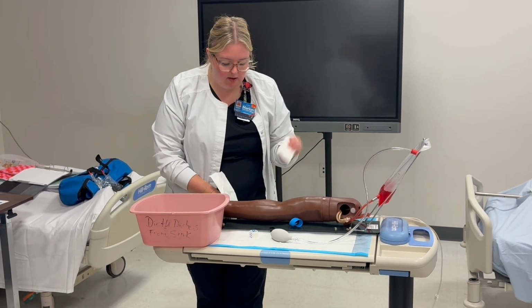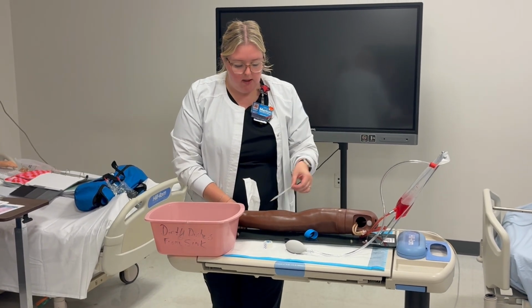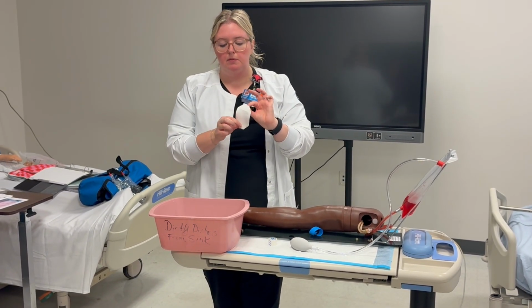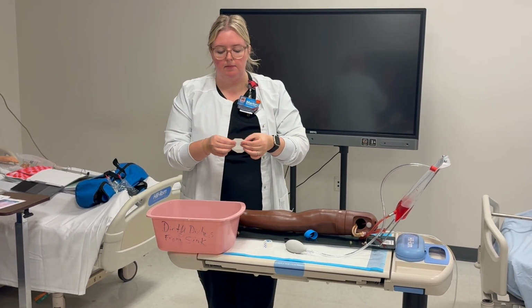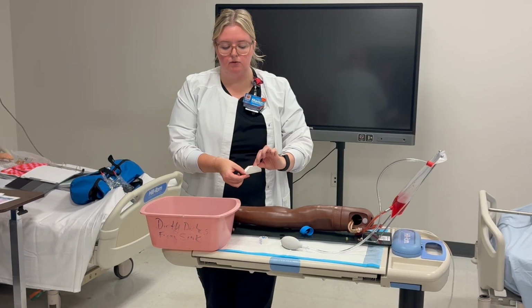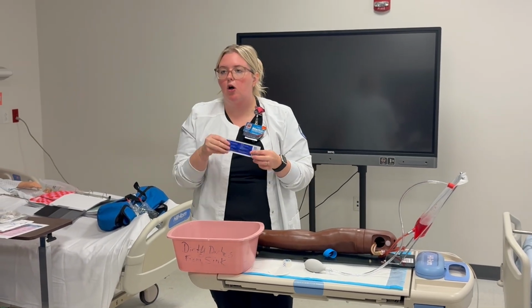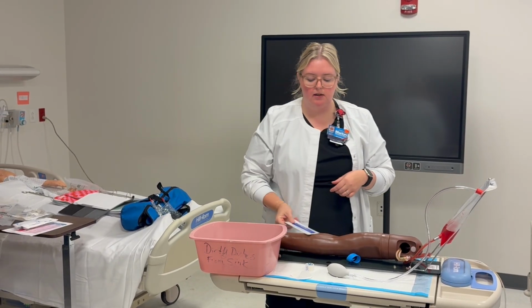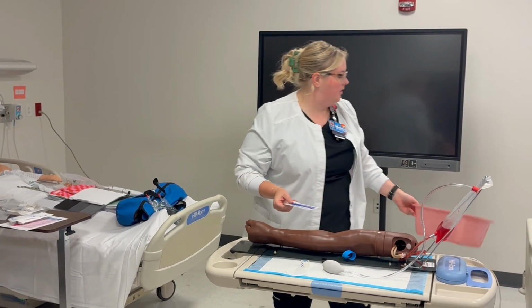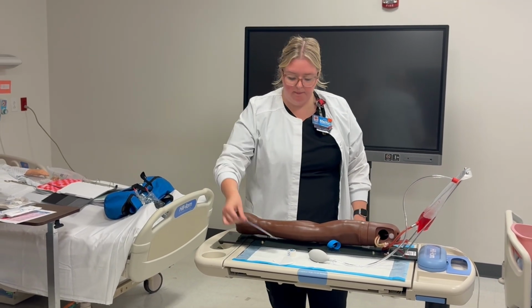Your kits come with gloves. We don't use them. You can use them if you want. This is called a Tegaderm. This will go on at the end. I'm going to fold it right here so that it's ready for me to pull apart. This is your alcohol or your solution to cleanse with. You don't have to take it out. In the checkoff, sorry, I'm blocking this, you can clean like this, okay?